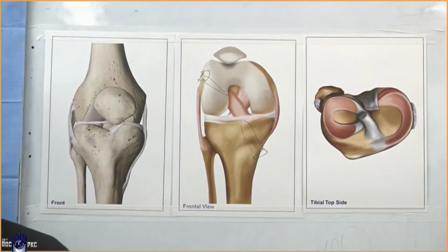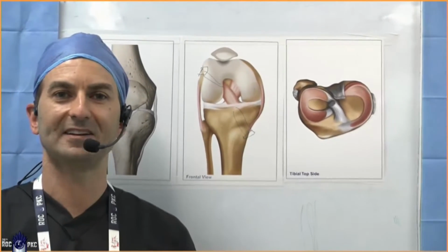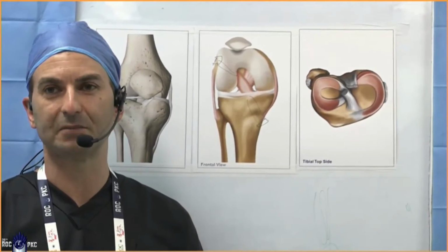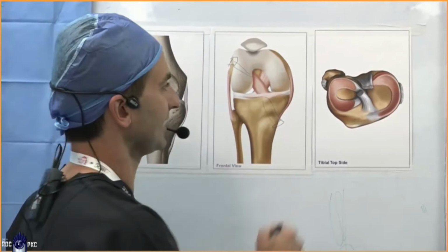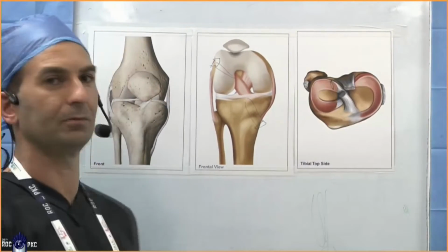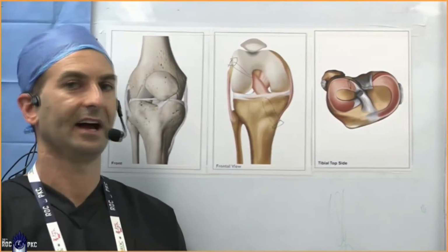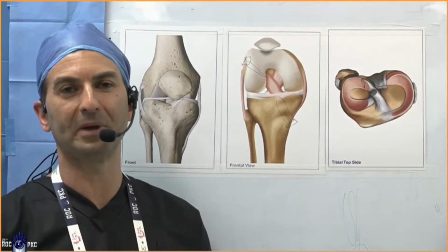In terms of the menisci, and you'll have seen the images, he has 2 significant meniscal injuries. Certainly on the lateral side, we can see that he has what looks to be a complete radial tear, probably a Krych variant near the meniscal root, but not quite near enough to do a root repair.